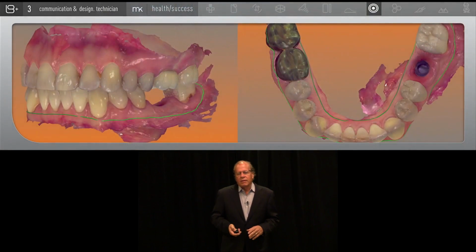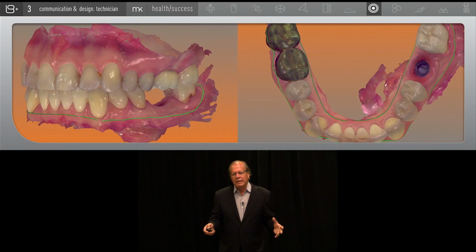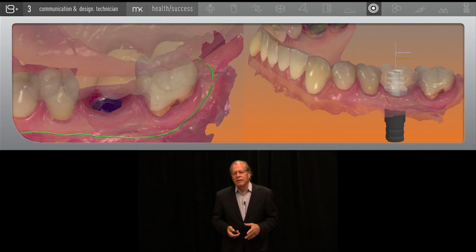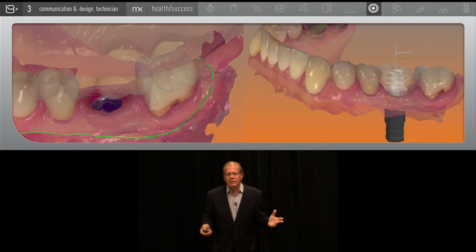So what we're doing effectively, with the patient in this particular case, is scanning the upper arch, scanning the lower arch, scanning the emergence profile, locking it in right off the bat so it's not going to change dimension, and then scanning the scan flag or scan body to record the position of the implant. And we are scanning the bite. No models, up in the cloud. That's all we need. By modem, obviously, everything is going to the technician.